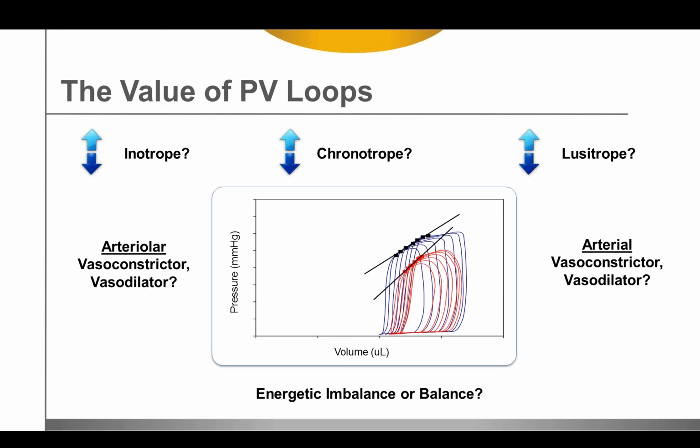So what are the properties again? Inotropy, velocity of cycling of heavy myosin heads, chronotropy, heart rate, lusitropy, ease of filling, and remember, lusitropy is manifested twice. It is manifested dynamically as the ventricle fills, that is the slope of this filling line, and is expressed statically as the ratio of end diastolic pressure to end diastolic volume. One of these, the filling, actually occurs after dP/dt max occurs.